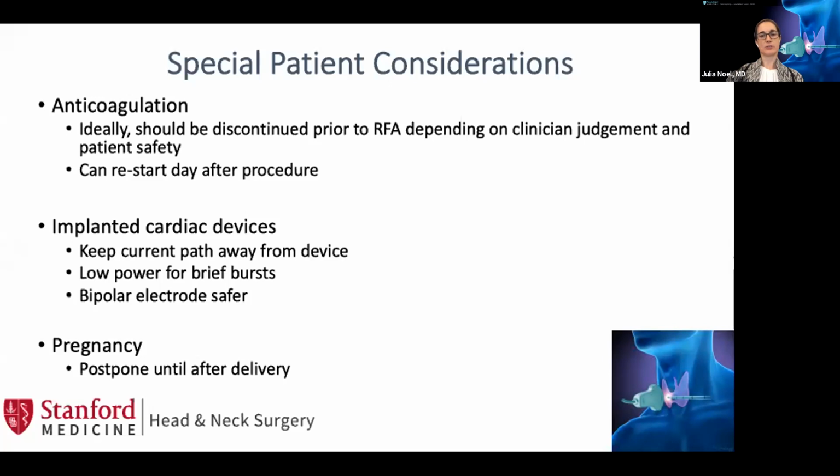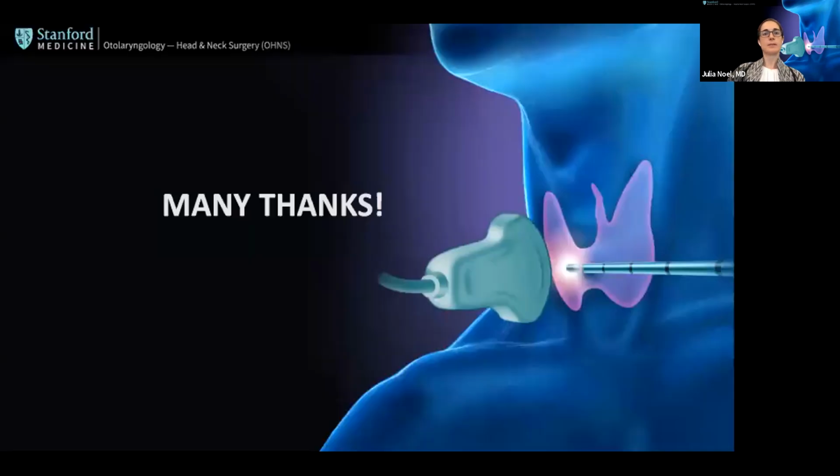Pregnancy is generally a contraindication, and it would be a very rare circumstance that would actually necessitate treatment during pregnancy. So the safest decision is to postpone until after delivery. And with that, I will stop sharing my screen.